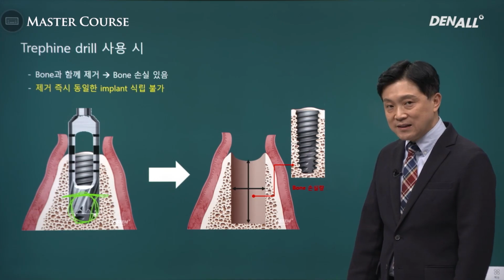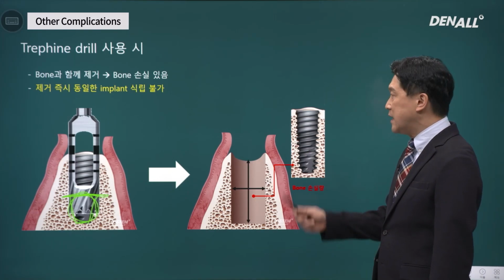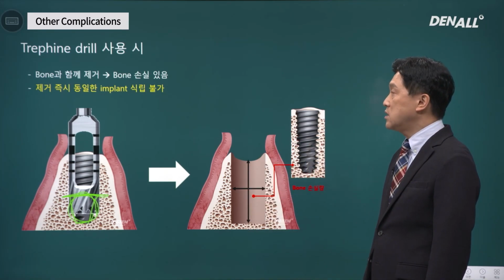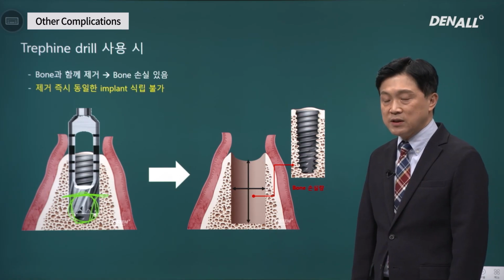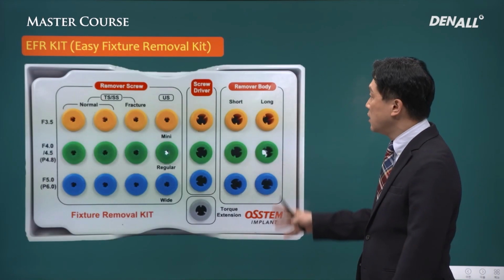However, there can be significant bone loss, so it can be a problem. In the past, this was the only way to do implant removal. These days, a lot of implant removal kits are available from different companies.